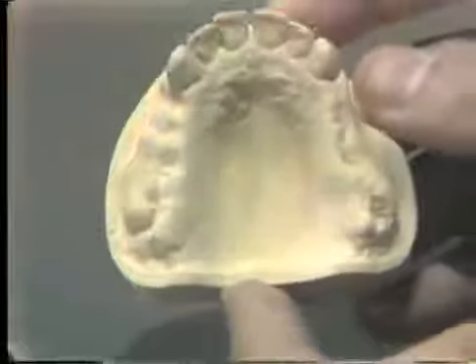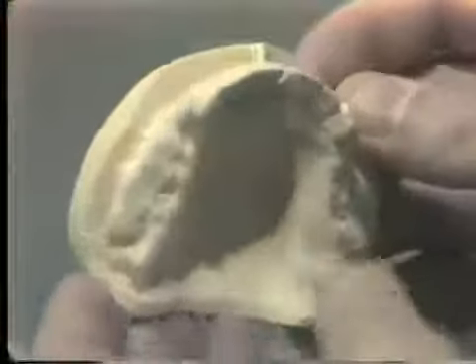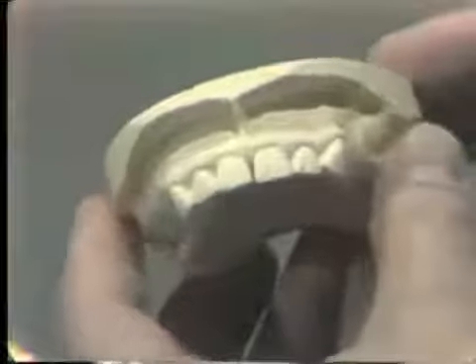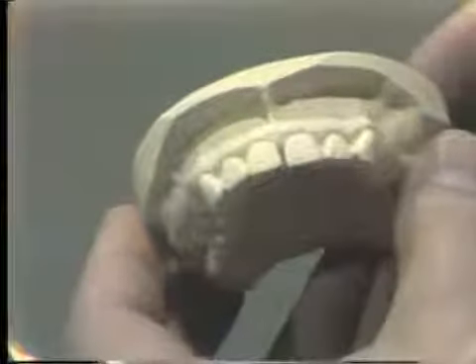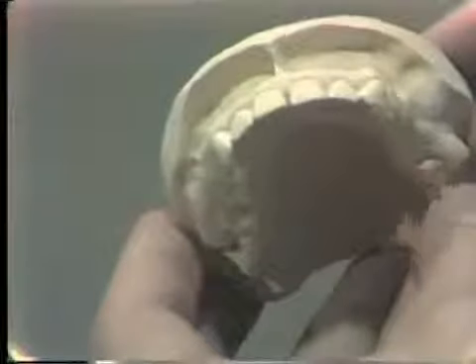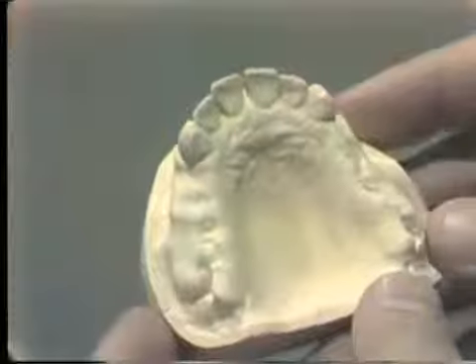Hopefully the impression will pick up the fovea palatini in the midline. It should include the buccal and labial flanges and the extent of the labial vestibule in the anterior area. Any large bubbles or voids should necessitate securing a new and more accurate preliminary impression.